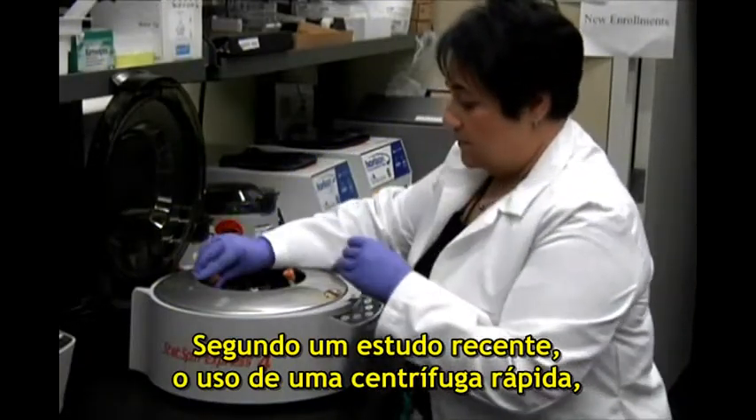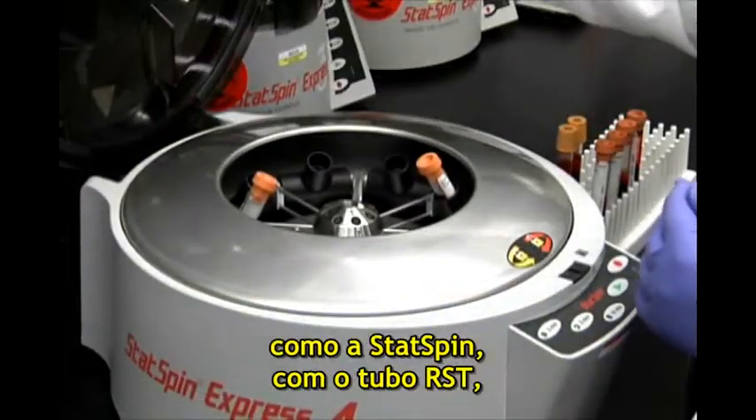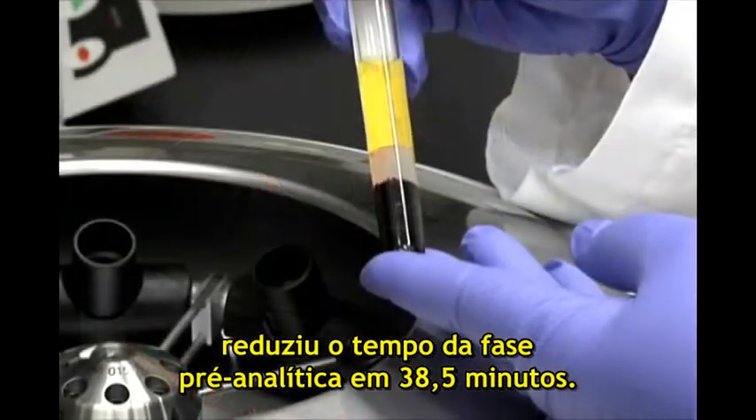A recent study showed that using a fast spin centrifuge, such as the Stat Spin, with the Rapid Serum Tube decreased pre-analytical time by 38.5 minutes.